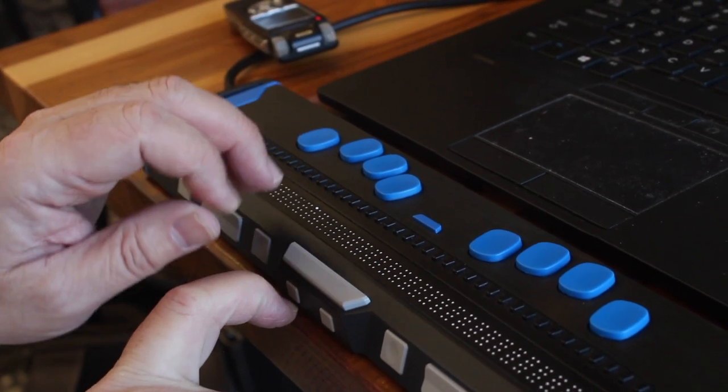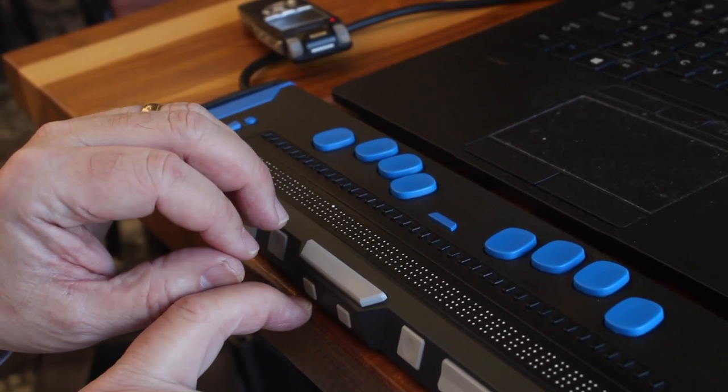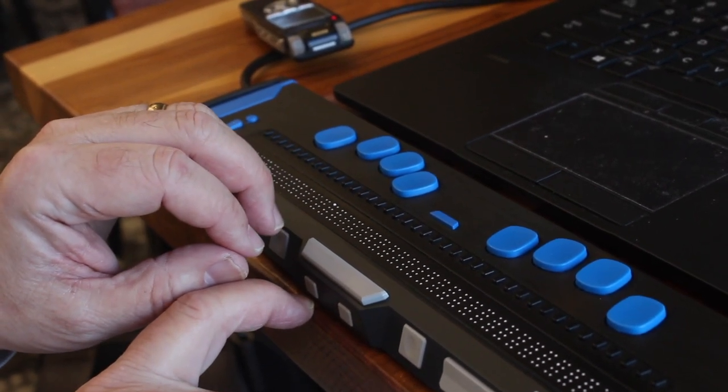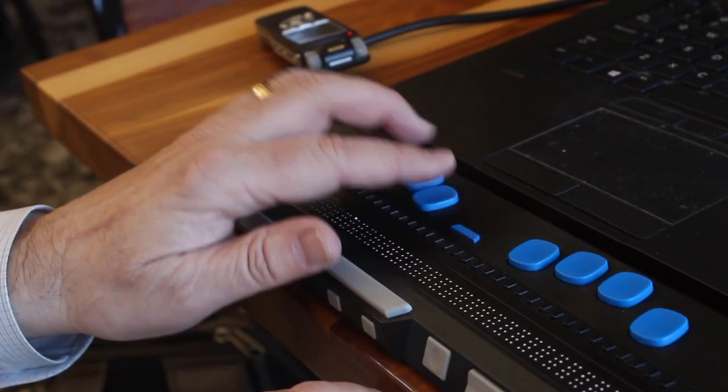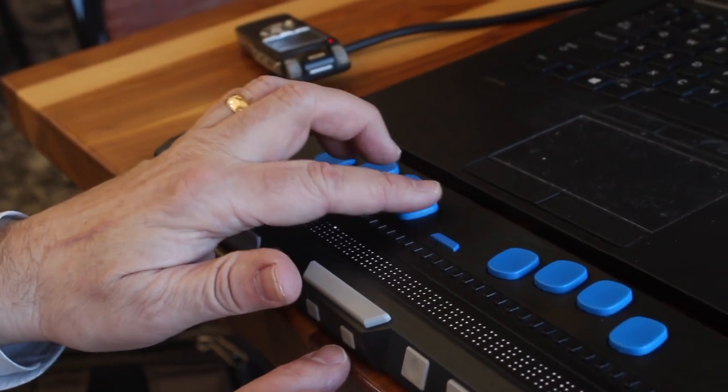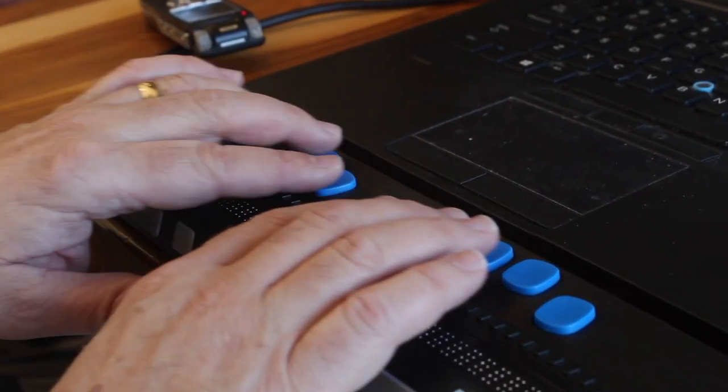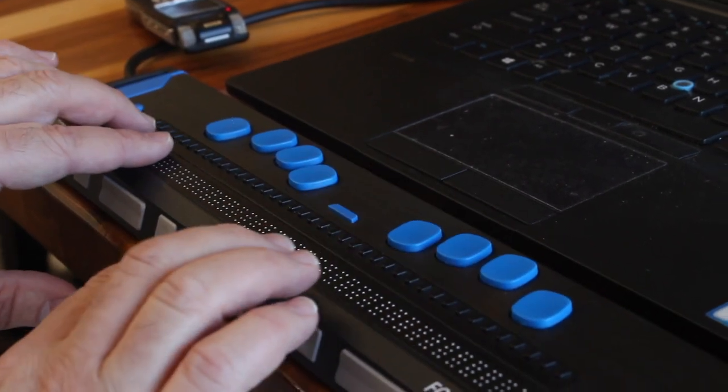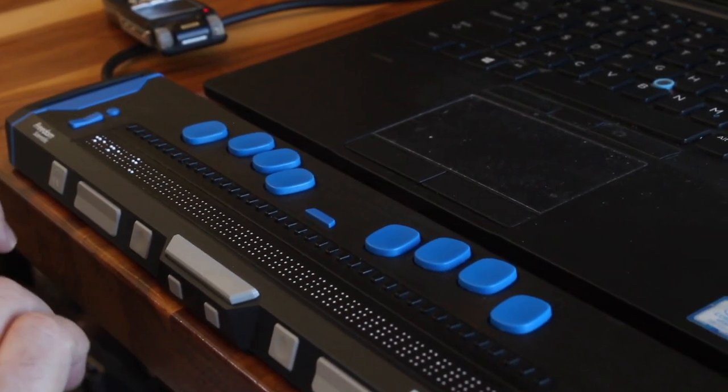I can press the letter H, which is dots 1, 2, 5. I'll do that now, and I'll press them one at a time. Dots 1, 2, 5, and the space.